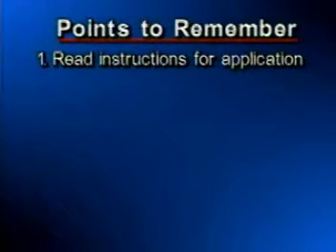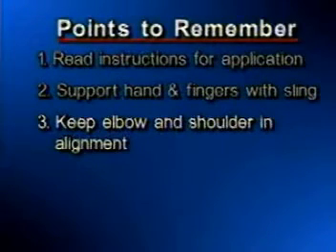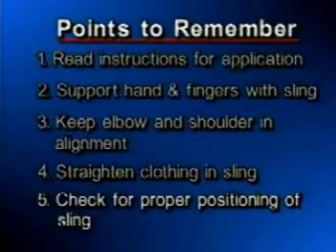I'd now like to give you a few common tips to remember that are very helpful with all slings. Number one, read the manufacturer's instructions for application. In-servicing and printed materials will be supplied by the occupational or physical therapist. Number two, support the hand and fingers within the sling. Number three, when the sling is properly applied, it should support the elbow and shoulder in good alignment. Number four, straighten clothing inside the sling to prevent pressure areas from sleeves bunching. And number five, check that the sling is positioned properly and does not pull on the patient's neck. Most frequently, directions and illustrations will be posted in a patient's room or in the care plan.